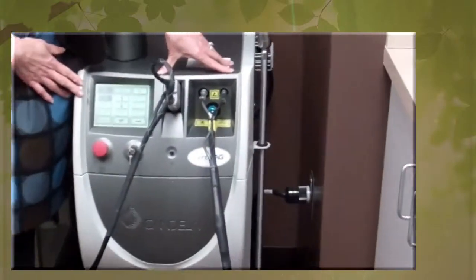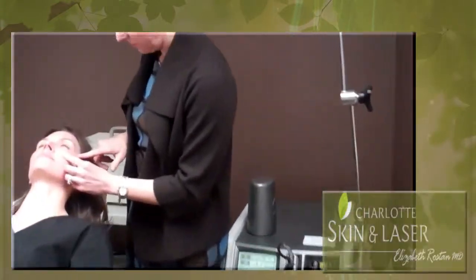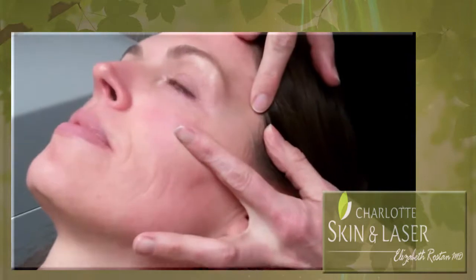We're using the Long Pulse 1064 to treat some under-eye dark blue veins that can contribute to dark circles under the eye and on the temple.